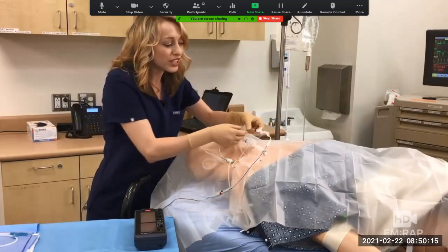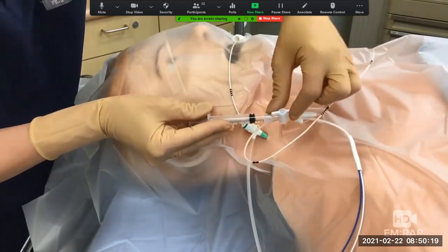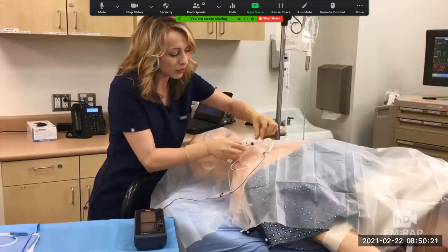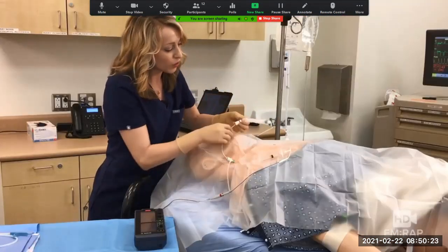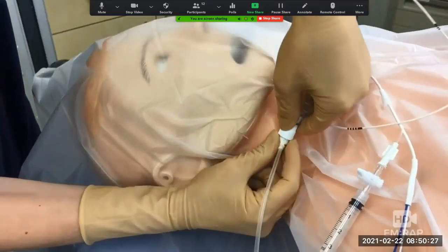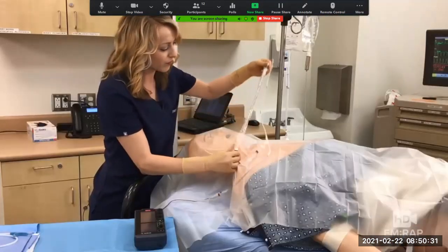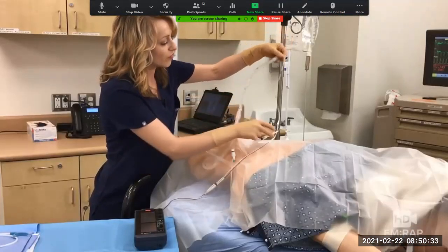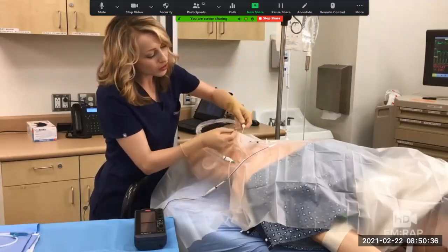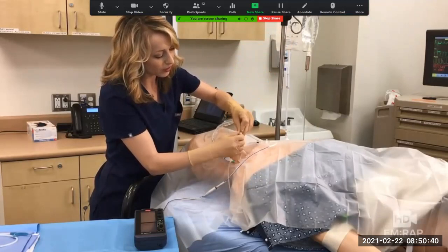So I'm going to deflate the balloon, and then lock this stopcock in place. And we're going to pull that sterile sleeve all the way down to the cordis, and it connects here. Now you can open up the sterile sleeve. And this actually locks when you twist this piece. It locks it in place on the pacing wire.